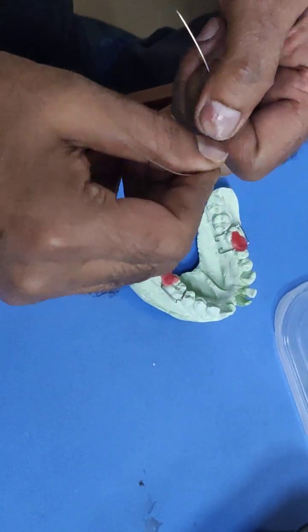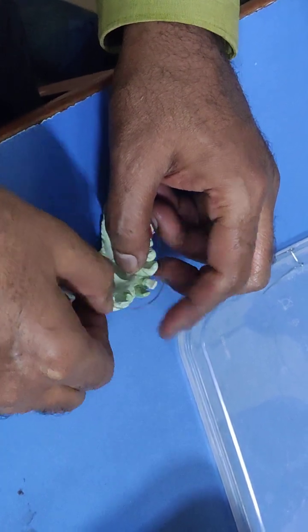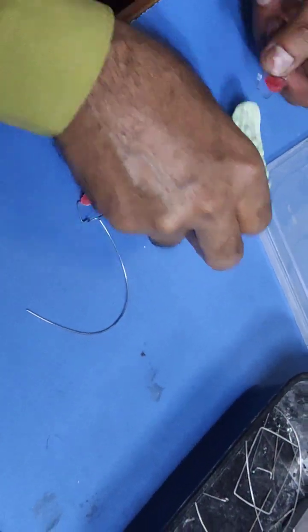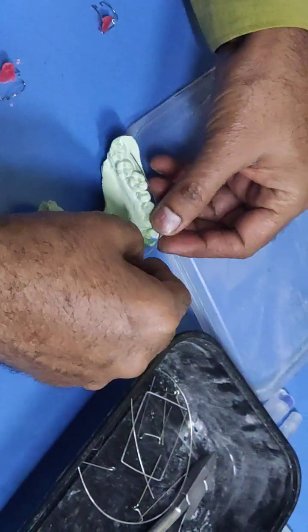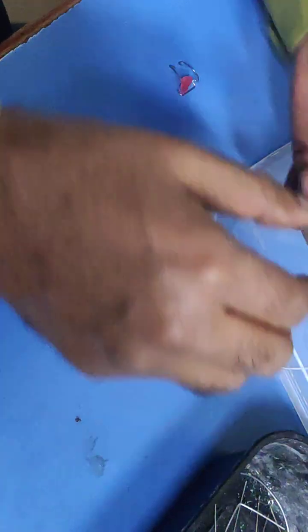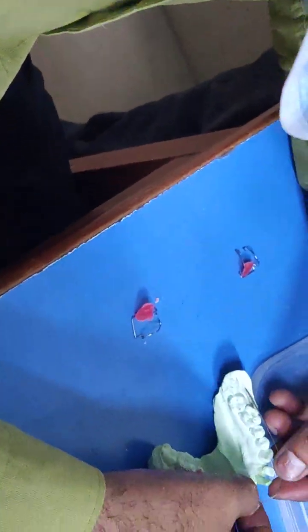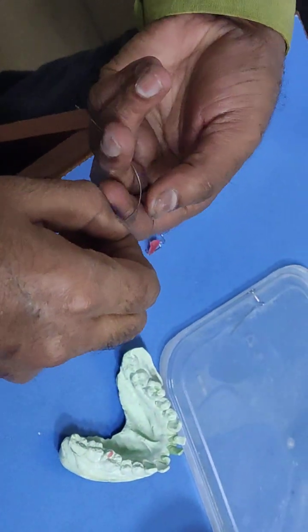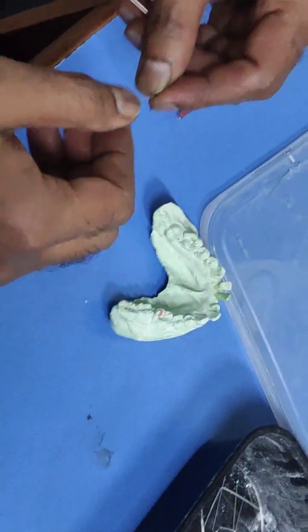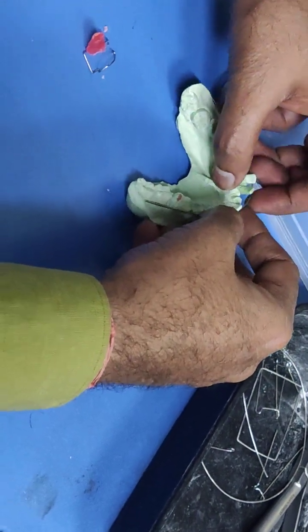Now proceed. It will be straight relatively, distal to canine. Sorry. No, okay.